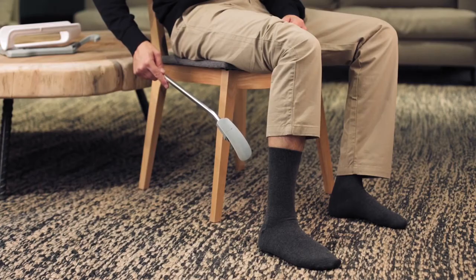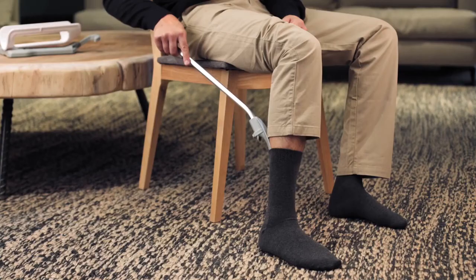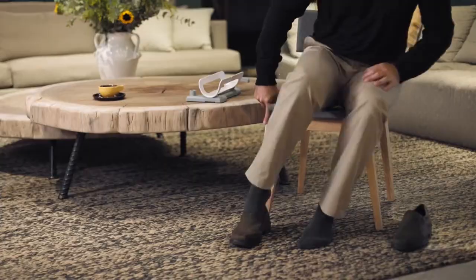To use it as a sock remover, slide the Socky tip down the back of your leg between your calf and sock, and push the handle down and twist it until the sock has been removed. You can easily use the Socky tip as a shoe horn.